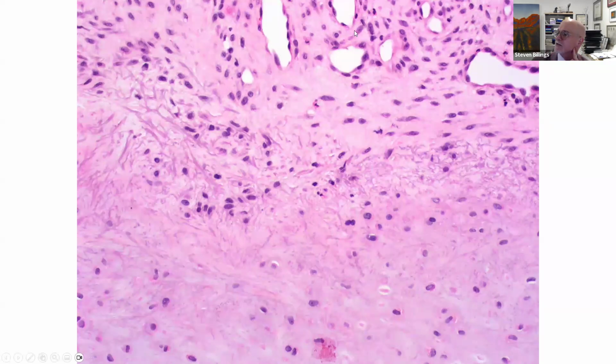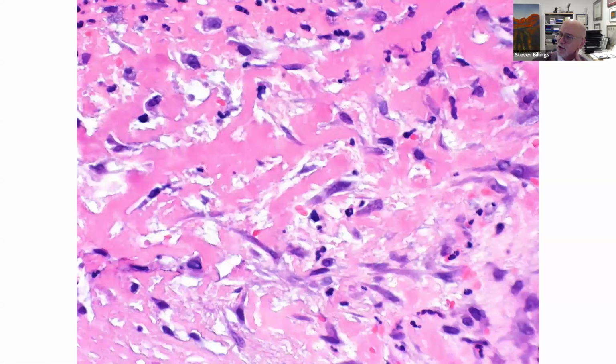And this is the reactive vascular proliferation often you see with it, this perichondrial fibroblast proliferation, this is the underlying cartilage, but those are less important features. The most important feature is this fibrin in that ulcer bed and the clinical presentation on the helix or antihelix of the ear.